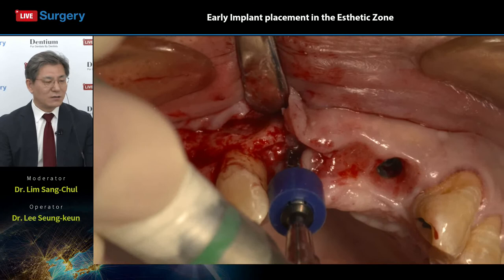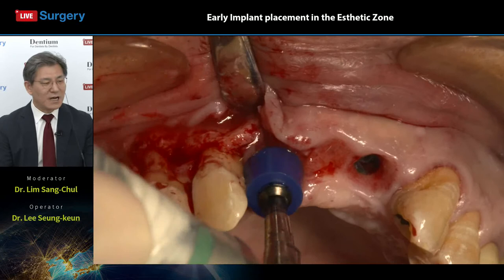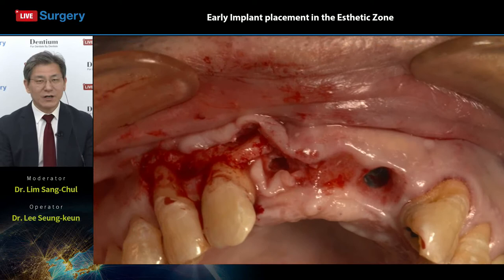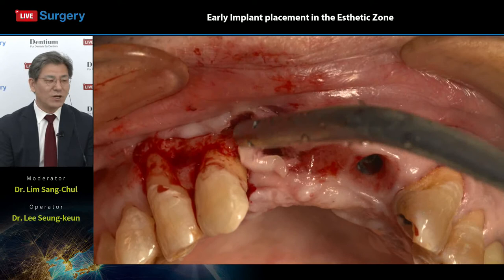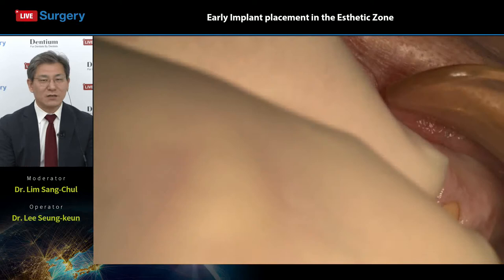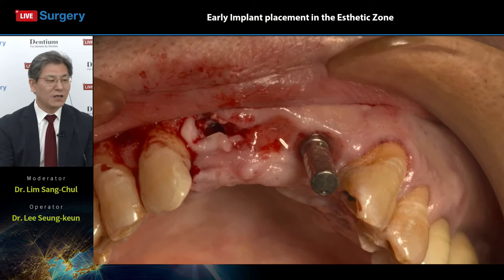Okay, now he is using the Dentium guide kit spacer. This blue rubber ring indicates the final restoration diameter. So this is the number 11 area, central incisor. Ordinarily we can use around 8 millimeter, right? Sometimes it depends on the space. Let me show you the 8 millimeter, 9 millimeter, blue colored lower position. Around a spacer is very useful for proper positioning when you have implant installation.